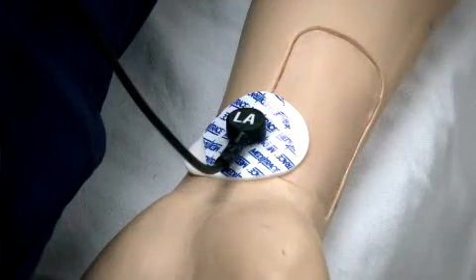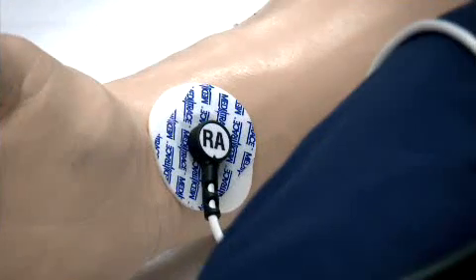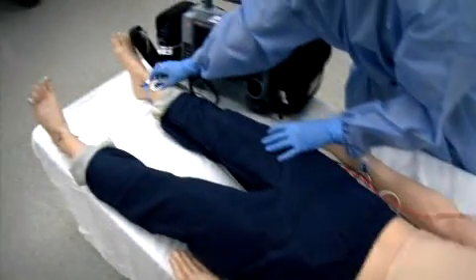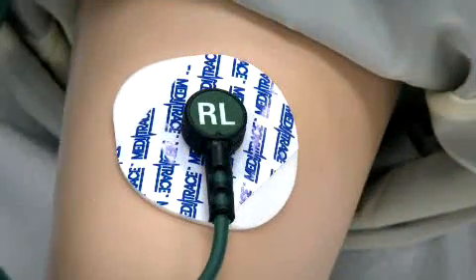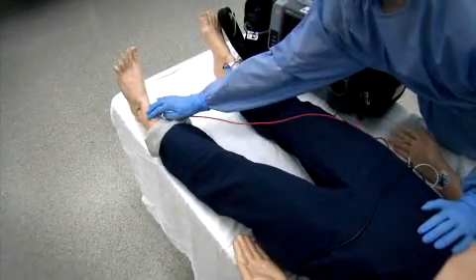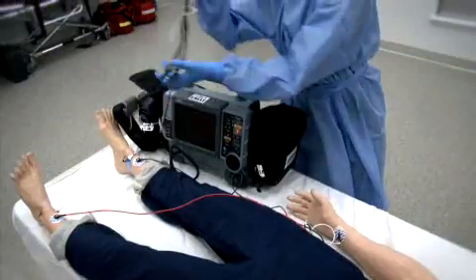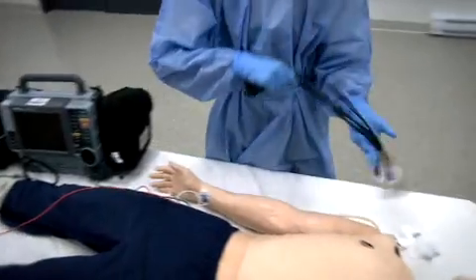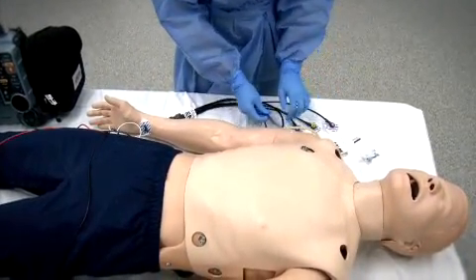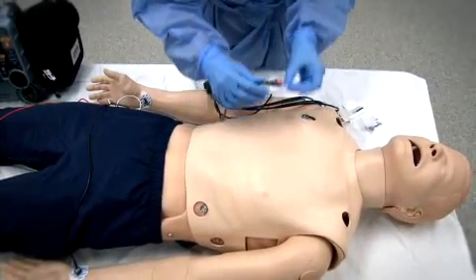From these limb lead electrodes, leads 1, 2, and 3, AVL, AVF, and AVR can be displayed and lead 2 rhythm interpretation assessed. Following the limb leads, the 6 precordial leads are applied to the chest. Landmarking for each begins with the V1 lead, which is applied at the 4th intercostal space immediately to the right of the sternum.